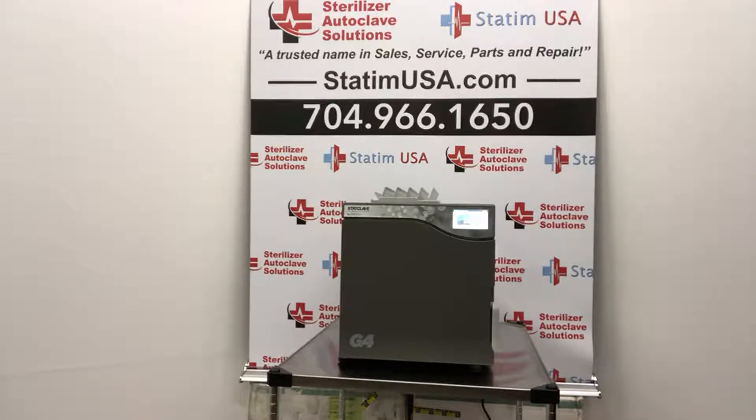I'm honored to give a high overview of the StatClave G4 Chamber Autoclave. This will be the first of many tutorials to come over the next several days and weeks. So, without further ado, let's dive in. The StatClave G4 Chamber Autoclave has remarkable speed, sterilizing and drying in as little as 38 minutes. The StatClave is a Class B vacuum sterilizer that incorporates both a pre-sterilization vacuum to improve steam penetration and a post-sterilization vacuum to improve drying.